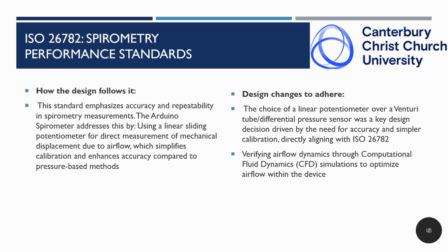Additionally, we have incorporated computational fluid dynamics (CFD) simulations to optimize airflow dynamics within the device, ensuring that it meets performance standards for accurate lung function measurements. By focusing on simplicity and precision, the device effectively adheres to the key requirement of ISO 26782, ensuring reliable and repeatable results for users.